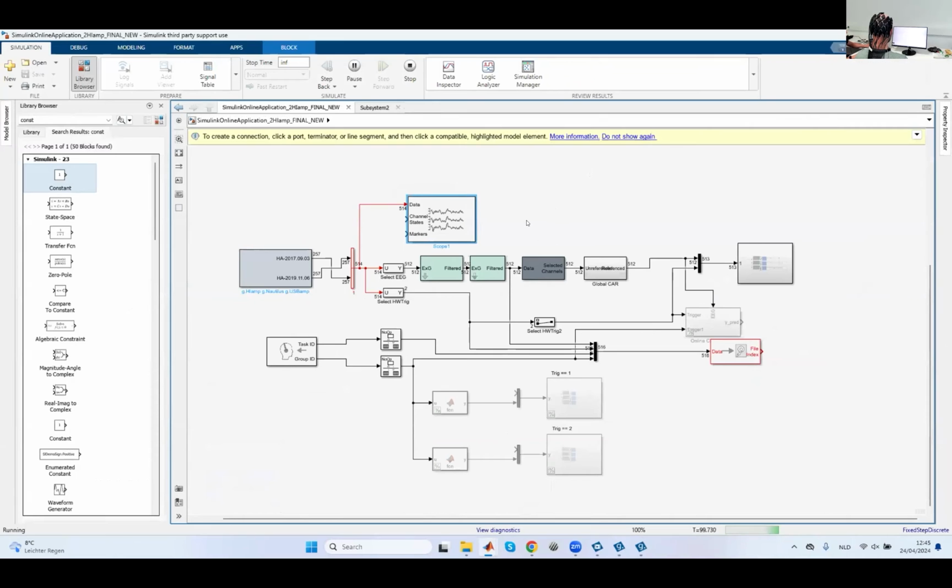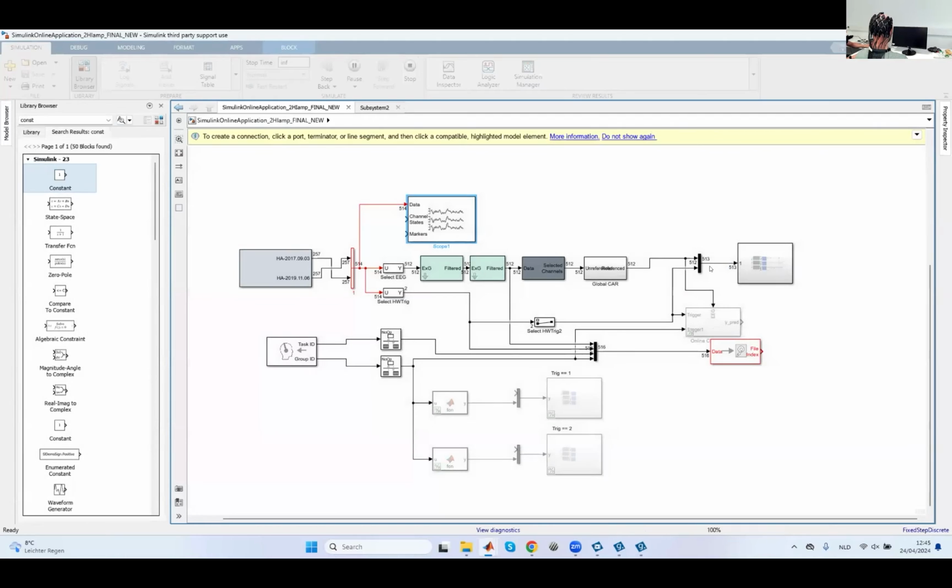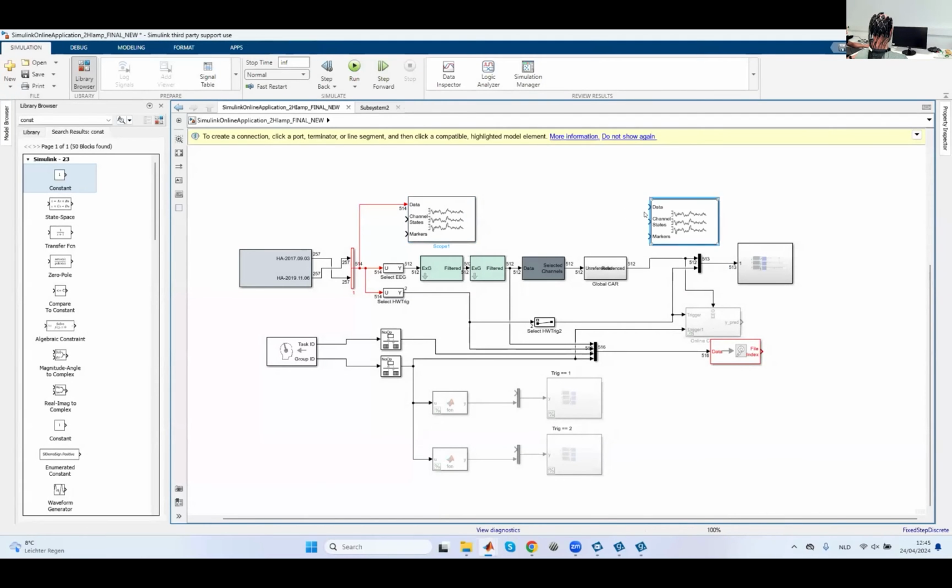This common average reference is important because we record monopolar, and we then use the trigger that I told you about. So we take the hardware trigger from the g.tec for plotting these averaged signals with the g.PANGOLIN system. And we use the paradigm presenter. As you've seen, the paradigm is presented with the timing that we set in the paradigm presenter, and we load the pictures there.